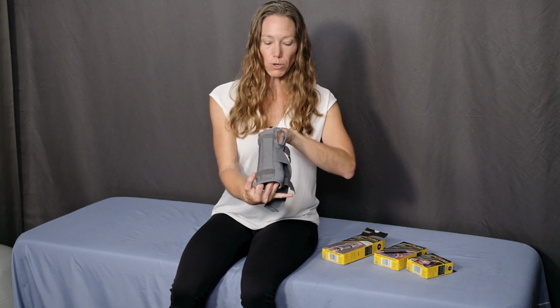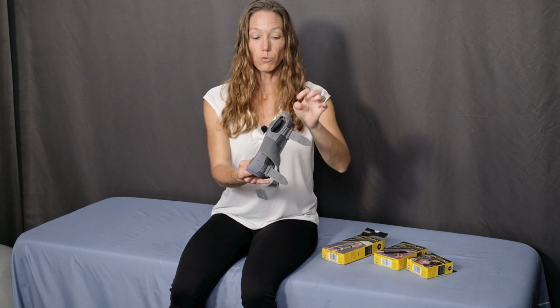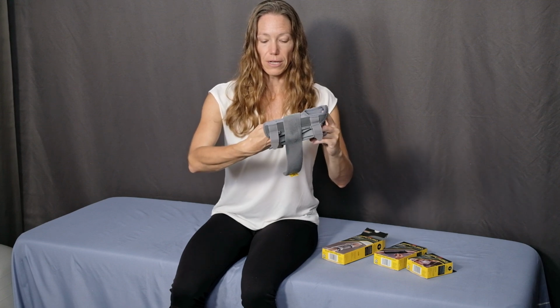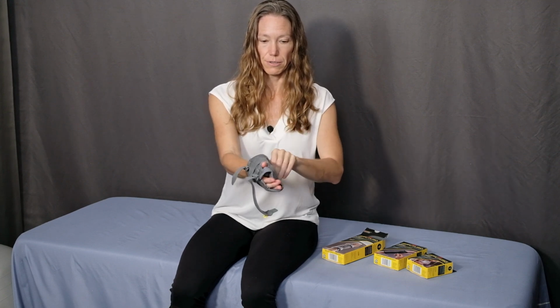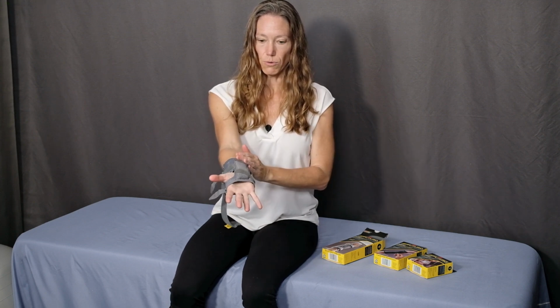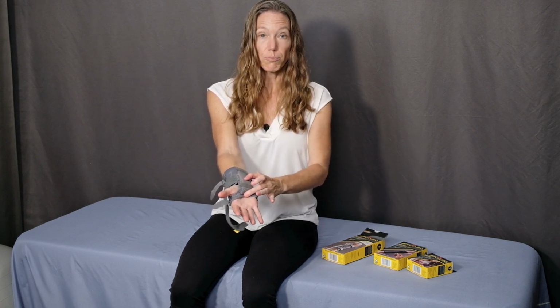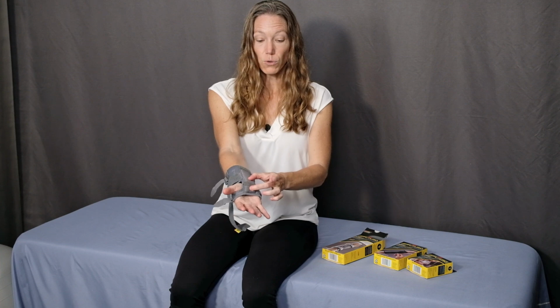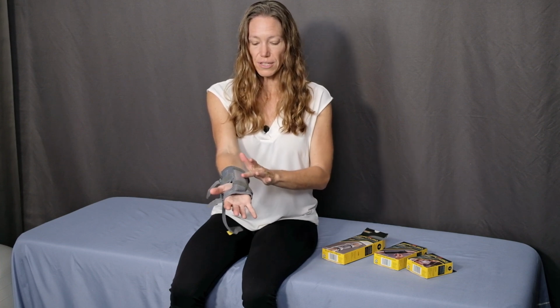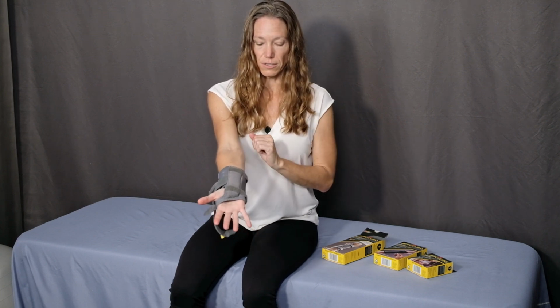Okay, so with the brace more open, now I can see this hole here is where the thumb goes. So I'm going to thread my arm down the brace here, slide it up, and put my thumb right through that hole. Now this brace has a metal stay in it, which supports and stabilizes my forearm and my wrist and into the palm of my hand. So that metal stay should go right through the front of the forearm, across the wrist, and into the hand.